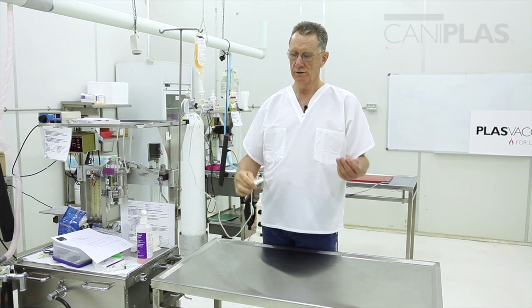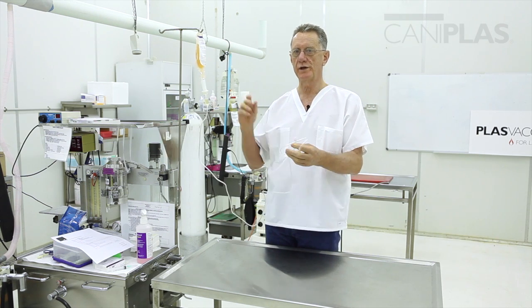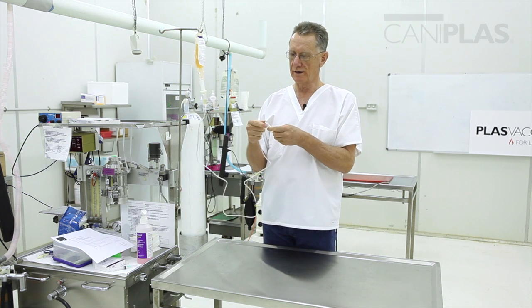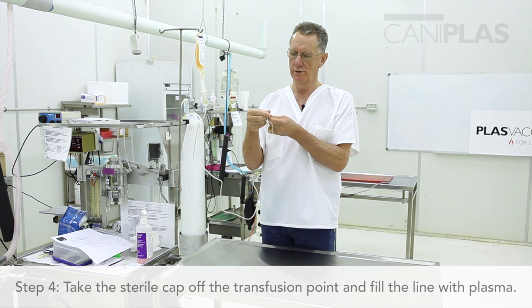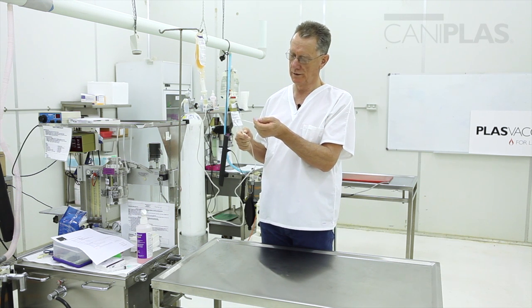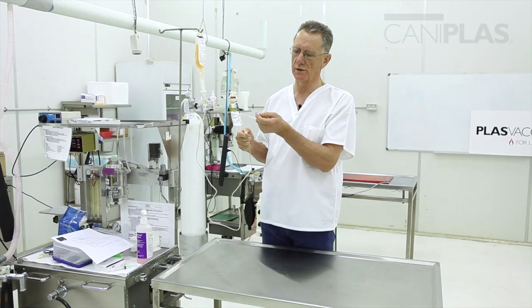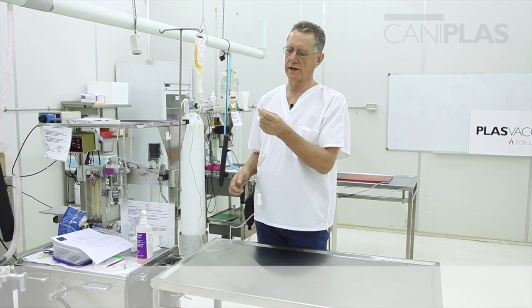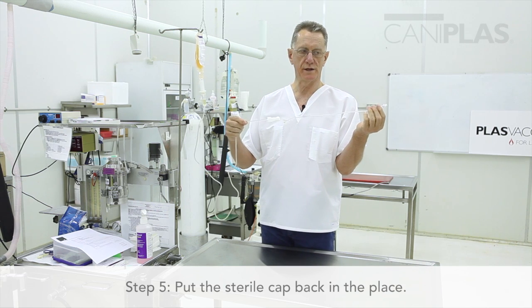Now I'm going to fill the line. It's best to have the tap as close to the end as possible, because you don't want to be reaching a long way away to turn it off or adjust the flow rate. I'll take the sterile end off — it's protecting the sterility of the transfusion point — and fill the line with plasma. We don't want to transfuse any air into the dog, which is not desirable. Now the plasma line is full, there's a drip of plasma on the end — I'll shake that off and put the sterile cap back in place. This plasma is now ready for transfusion to begin.